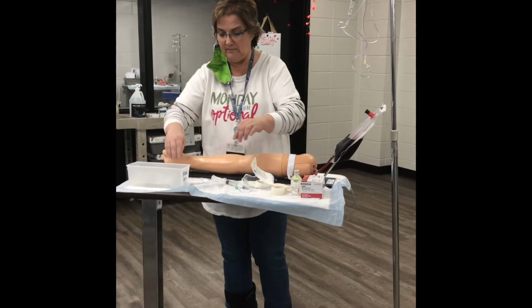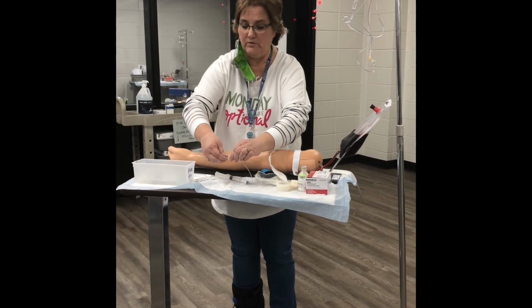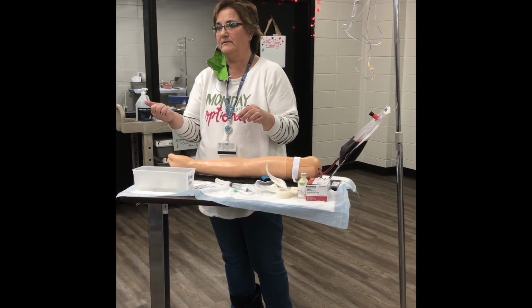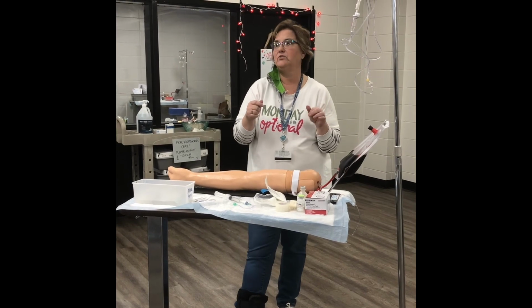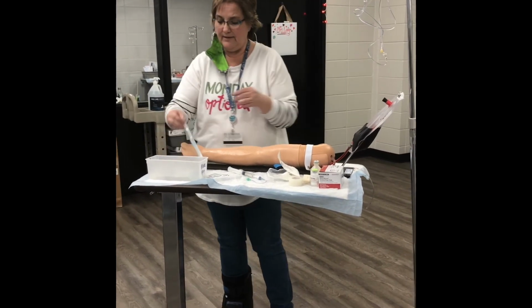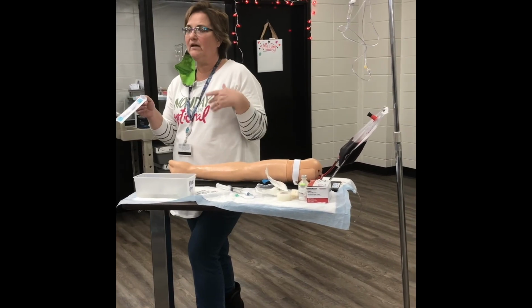The first thing you need to do is loosen this, because when you get ready to hook that to your IV, you're only going to have one hand. When you first take that loose, you'll see that it's on there pretty good. So we're going to do that. Notice I don't have gloves on because I don't need them on yet. You only need gloves on once you stick.